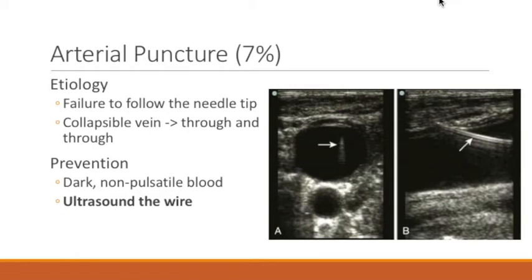You have one last final check that's really important to do. We've had several catheters end up in the carotids over the years, and every time that happens, they forgot to ultrasound the wire. So before you dilate the artery on accident, be sure to ultrasound and make sure the wire not only enters the vein, but continues sliding all the way down the neck towards the clavicle to make sure it doesn't come out the back wall into the carotid behind it. And then rotate your probe 90 degrees to view this in the long axis view and make sure your wire again is in the vein. This is the most common step forgotten when catheters end up in the carotid.